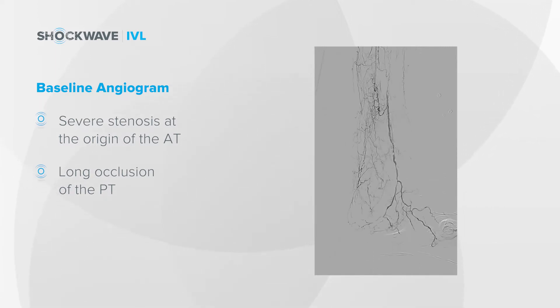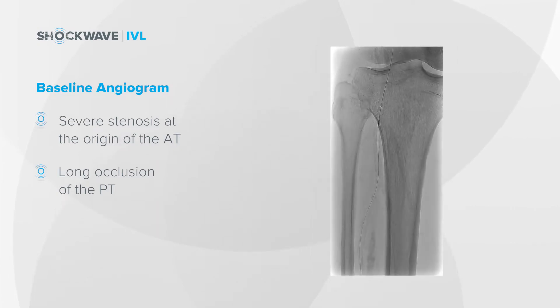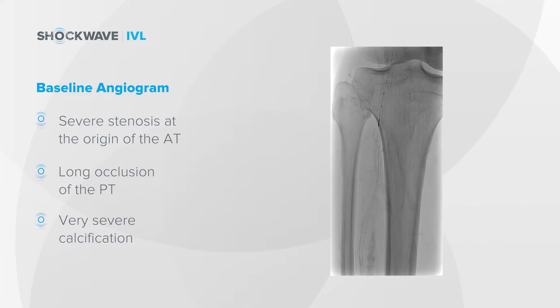If you look here on this farther down picture, you can appreciate the severity of the disease distally down near the level of the ankle, and the fact that there's very severe calcification throughout this vessel. You can appreciate the severity of the calcium throughout each of these tibial vessels, as shown here on this picture on the right.